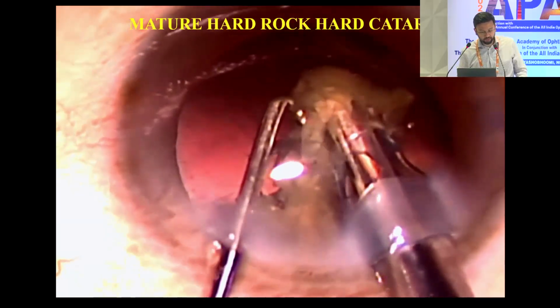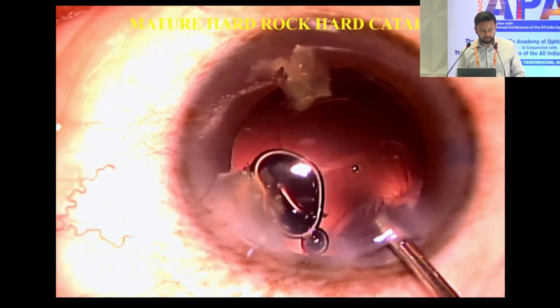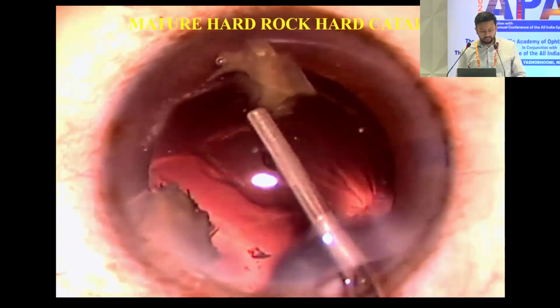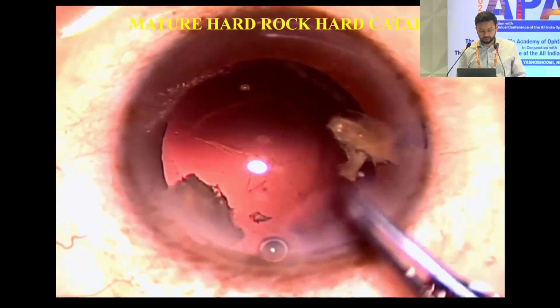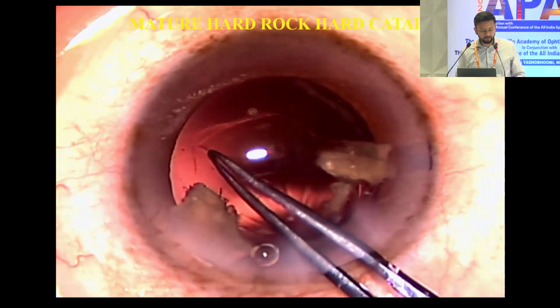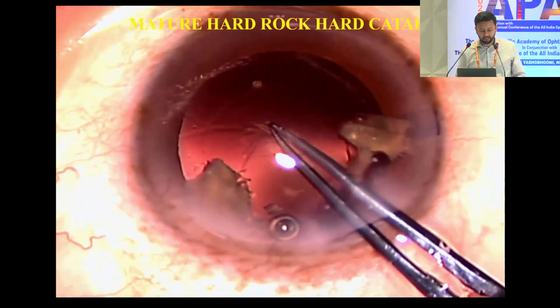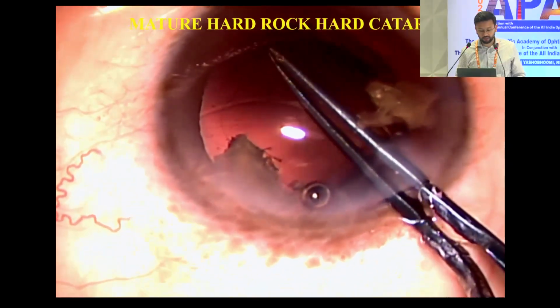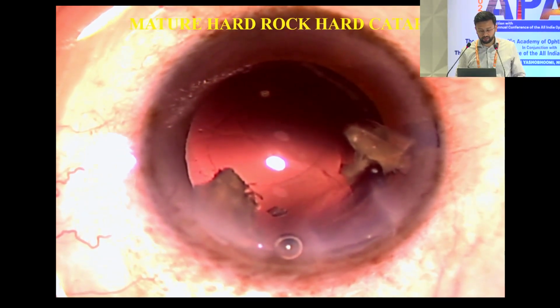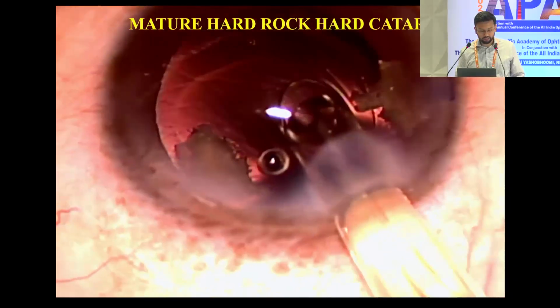So this is a case of a mature hard cataract. While aspirating the final few fragments, we see that we have inadvertently created a posterior capsular tear. So here we immediately stop and put lots of visco, form the chamber, mainly to move the fragments away from the tear and push the vitreous back. Here we are attempting a posterior capsulorhexis to regularize the margins of the tear so that the tear does not extend towards the equator, and by completing the rhexis, the implantation of the IOL becomes even easier.